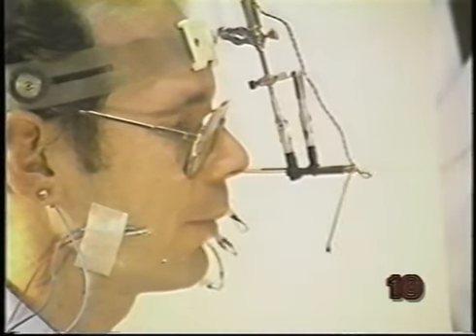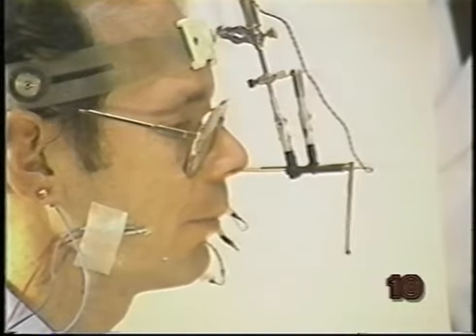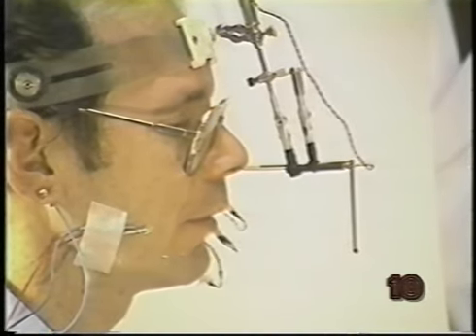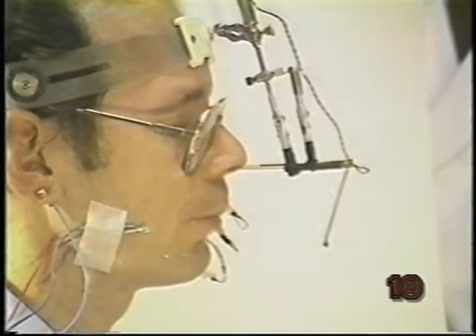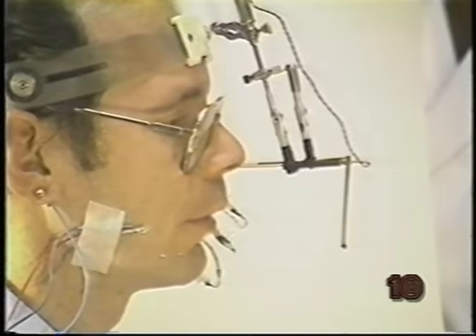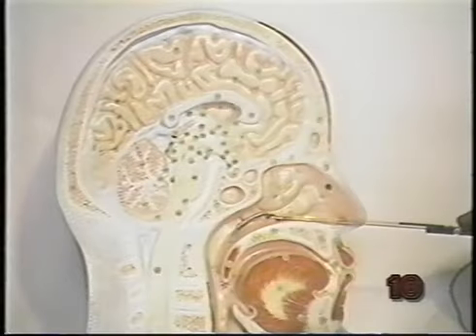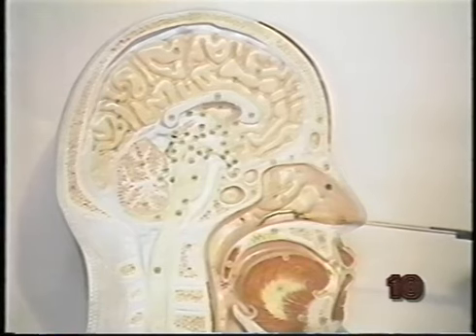Finally, an external clamp attached to a headband is used to stabilize the position of the velotrace over the course of the recording session. Here we see the relative size and positioning of the velotrace in a life-size model.